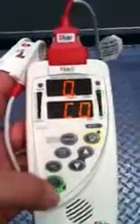Very simple unit to use. To turn it off, press and hold the green button.